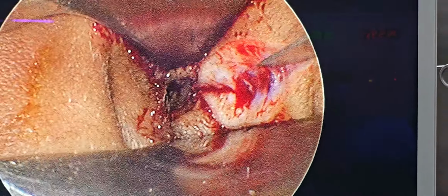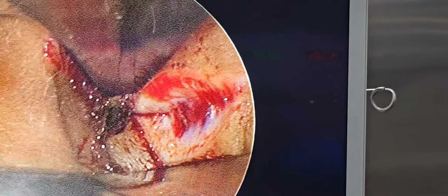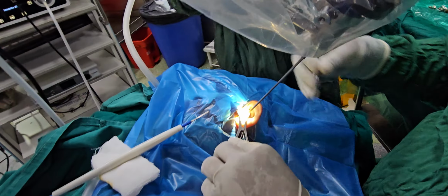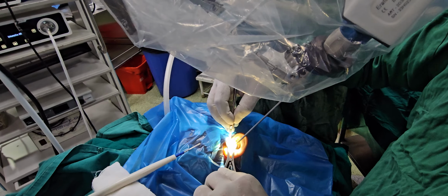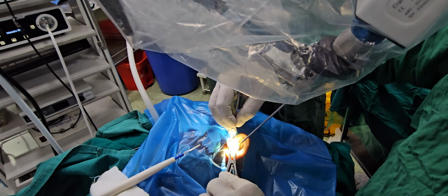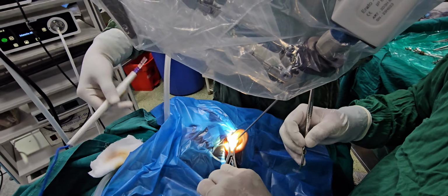See, the vessel is there always. So, maybe first, cauterize that. The vessel, many of the time. Suction pan. Yes, sir. So we'll cauterize and then we'll suction. Now, cauterize.